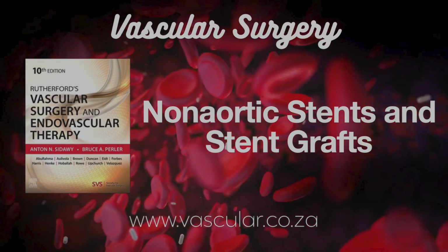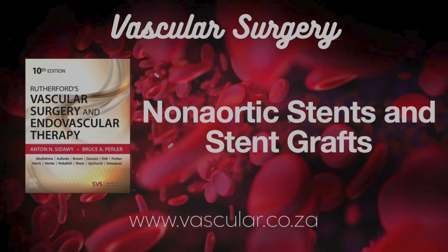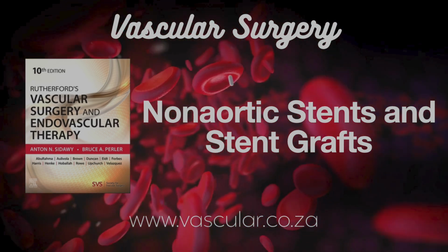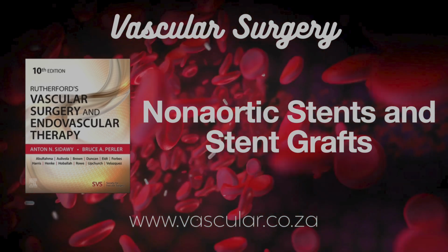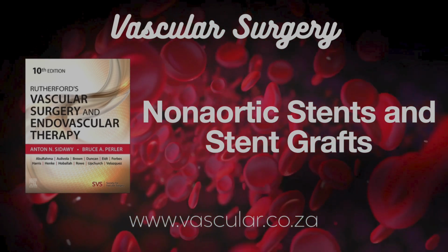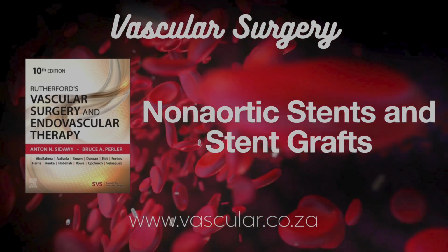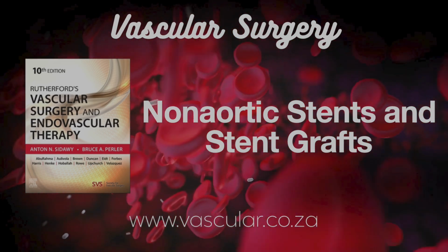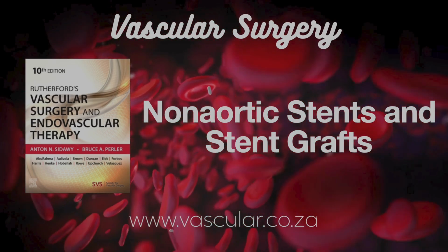Okay, that sets the stage for how surgeons actually choose. The chapter outlines several factors. First, plaque morphology, the nature of the blockage itself. Yeah, if the plaque looks really unstable or likely to break apart, you might see that on ultrasound or CT sometimes. Then a covered stent or maybe a closed cell bare stent is often preferred to try and contain that debris. Like putting a lid on it. Kind of. Covered stents are also good if you suspect there's fresh clot involved.